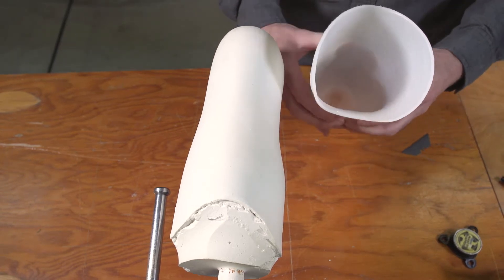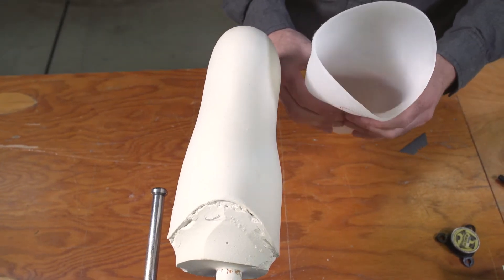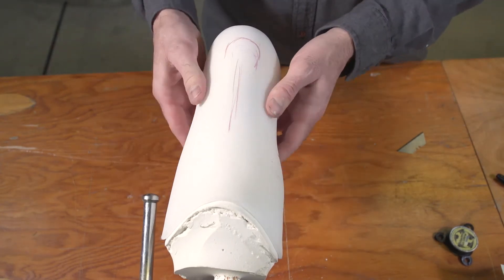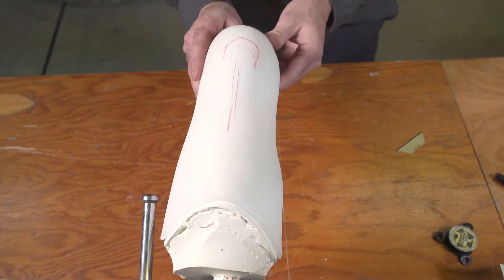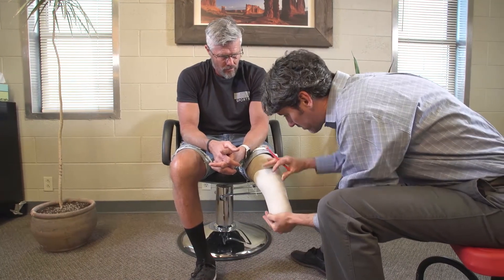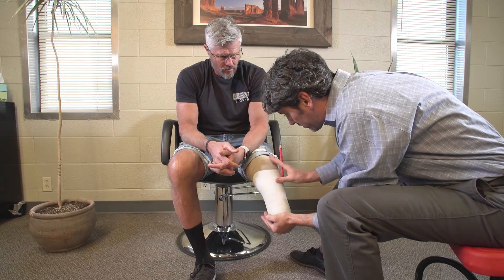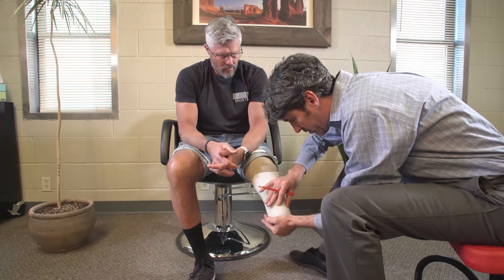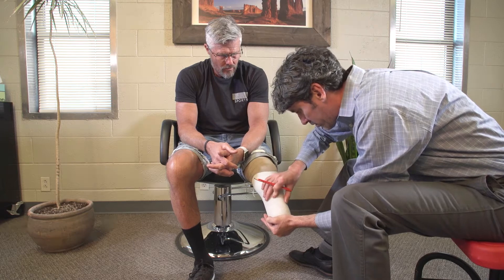One thing to keep in mind, the RevoFit system works best with a flexible insert. The insert helps distribute pressure evenly throughout the socket, and prevents acute pressure around the movable panels. We recommend that you make the flexible insert in the check socket phase, and use it for both the check socket and the definitive socket.